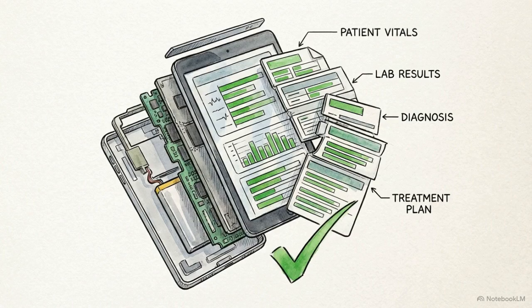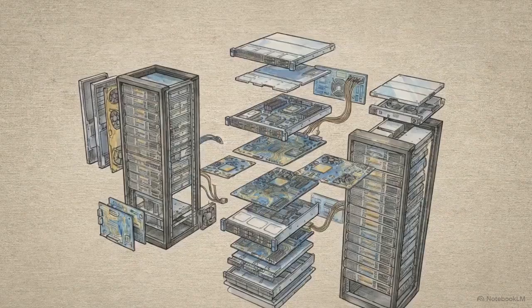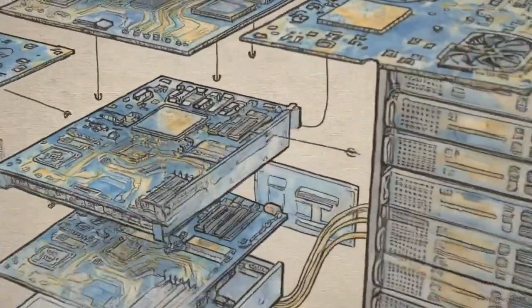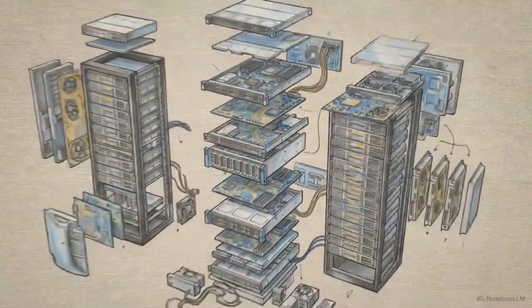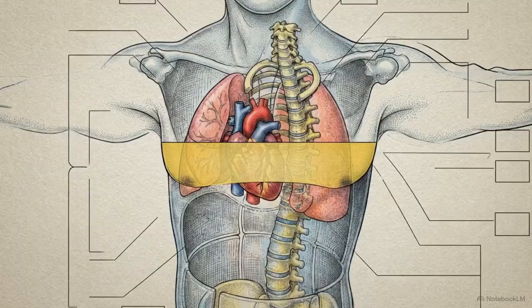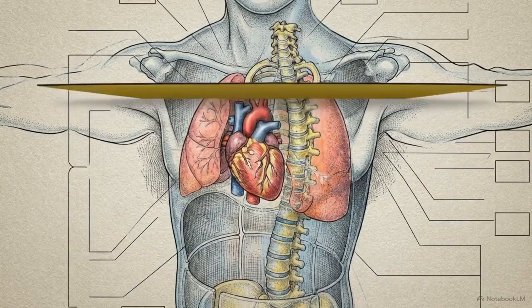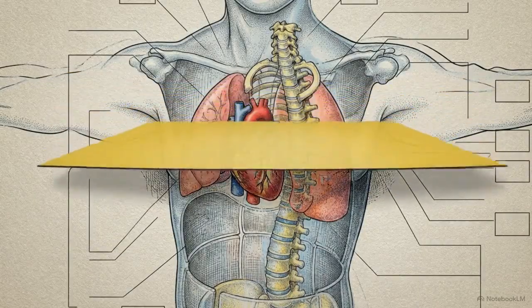The final radiology report translates raw Hounsfield units into actionable, normalized percentiles to ensure the data is useful for primary care providers. Mastering the physics of thresholding and the algorithms of scaling reveals the high-fidelity clinical insights embedded within millions of routine scans. Opportunistic screening creates a comprehensive quantitative map of a patient's future health out of a single diagnostic scan.